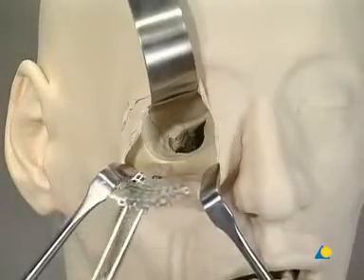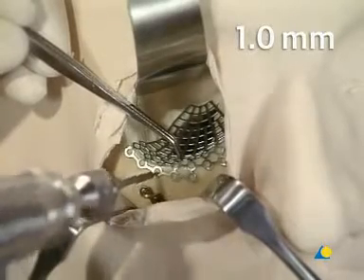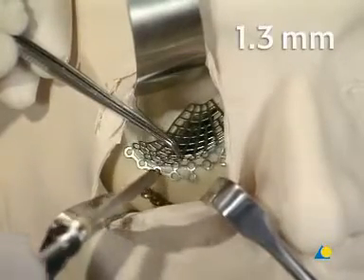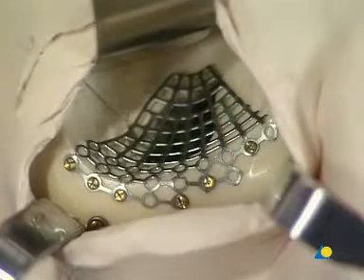The plate is contoured to meet the anatomical features of the orbital floor and rim. Proper contouring is crucial to restore the normal orbital volume. When inserting the plate, the soft tissues must be properly retracted to avoid entrapment. The first hole is drilled into the infraorbital rim using a 1 mm drill bit with 6 mm stop. A 6 mm long 1.3 mm screw is inserted using the 1.3 screwdriver with holding sleeve. Additional screws are inserted until the orbital floor mesh plate is securely fixed in place.